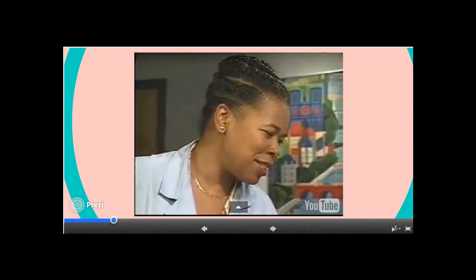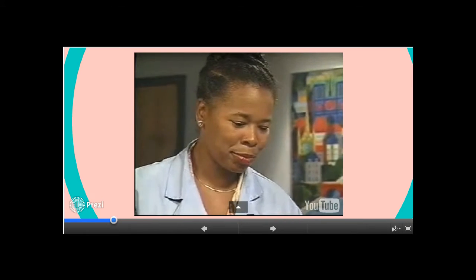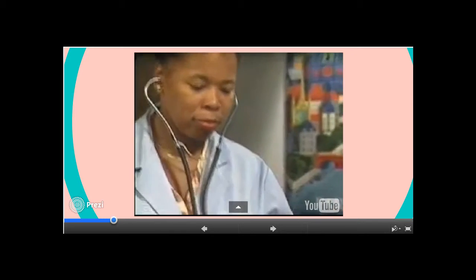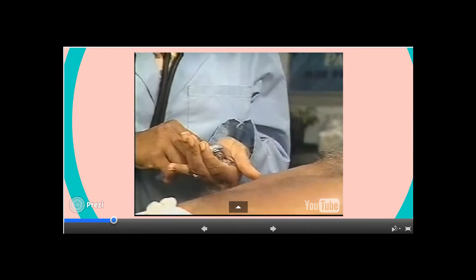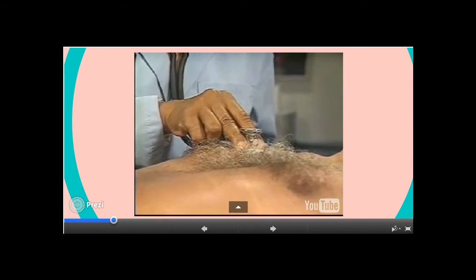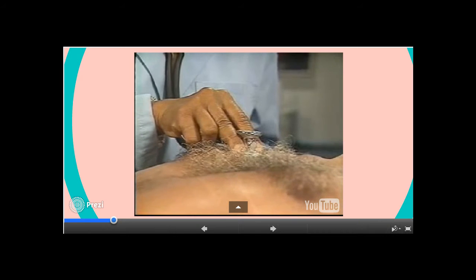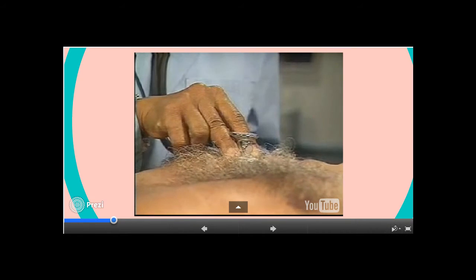What I'm going to do now is listen to your heart in the various areas of your chest. Now adjust your stethoscope so that you'll be listening through the diaphragm. When pressed firmly on the chest, the diaphragm is best for hearing relatively high-pitched sounds, such as S1, S2, the murmurs of aortic and mitral regurgitation, and pericardial friction rubs.